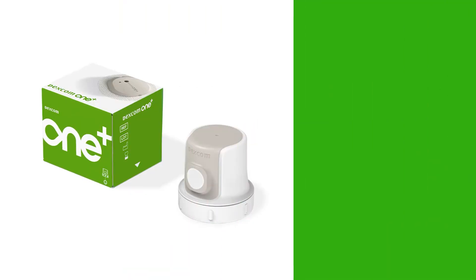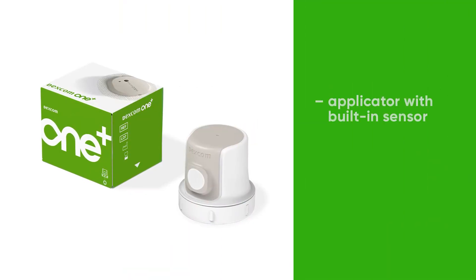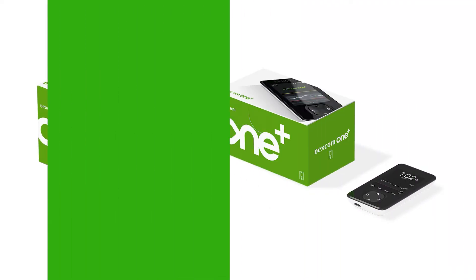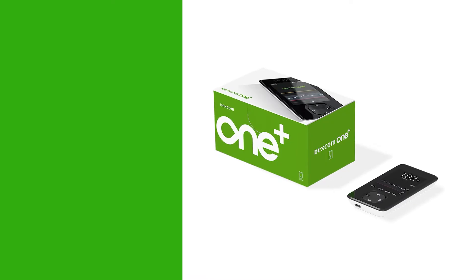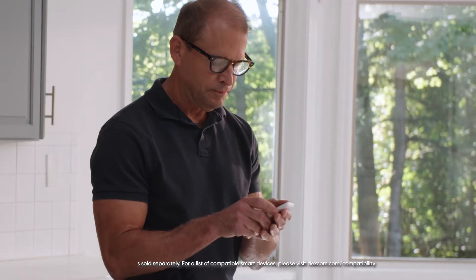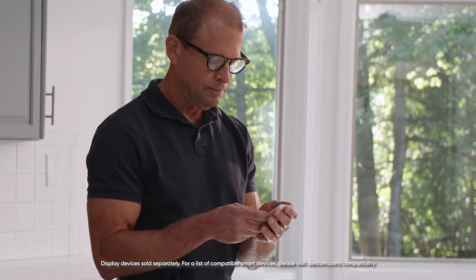The Dexcom One Plus sensor box contains your applicator with built-in sensor, overpatch, and your instructions for use. Your Dexcom One Plus receiver box contains your receiver, USB cable, and power adapter. Your receiver has four buttons.